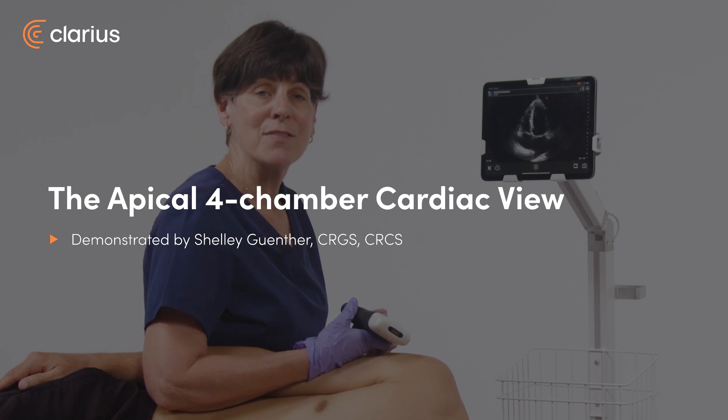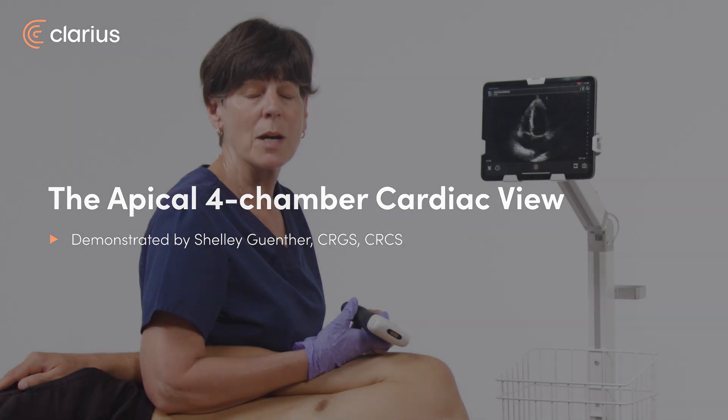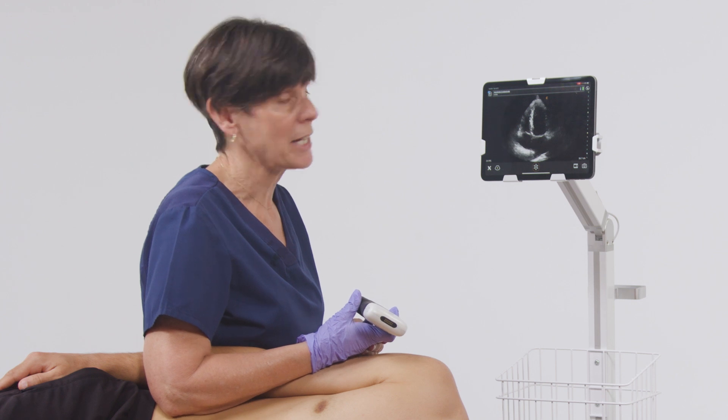Hi, my name is Shelley and in this video I'll show you how to obtain a cardiac four-chamber view, otherwise known as the apical four-chamber view, using the Clarius PA scanner in the cardiac preset.